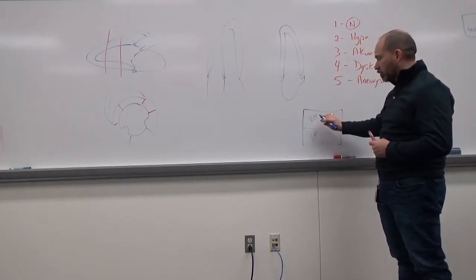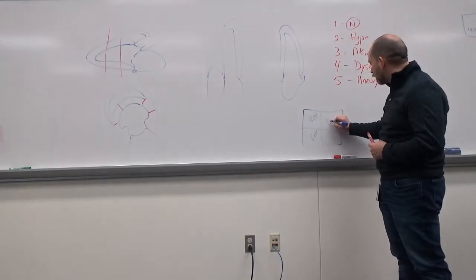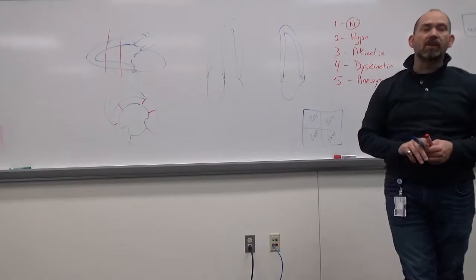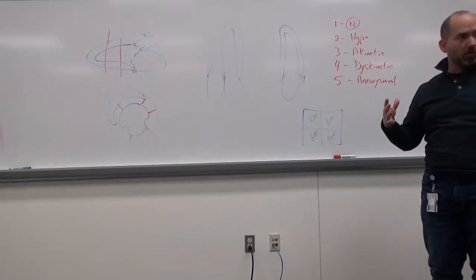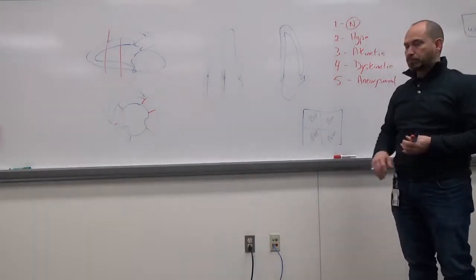So the way they're always displayed is resting on the left side and post-stress on the right side. So again, in a resting set of images, if I'm taking this on an ultrasound system, I take my set of 4 first, and I will actually take a clip of them, all 4 running at the same time on the screen.